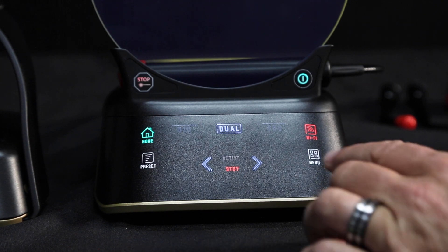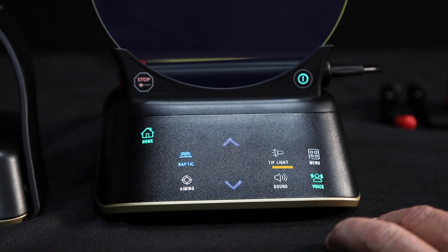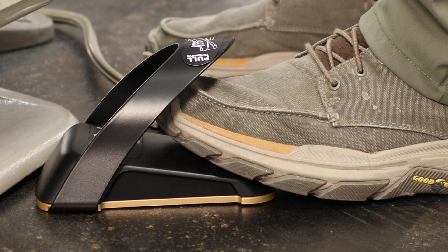Pressing the menu button brings up the options for haptic settings, aiming light, tip illumination, and sound settings. The Gemini Evo foot pedal is equipped with haptic feedback.